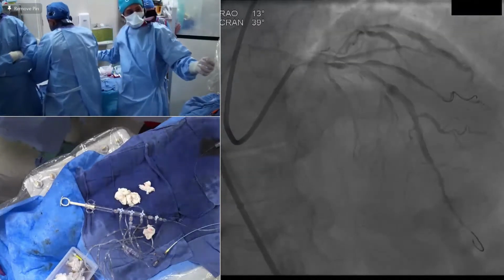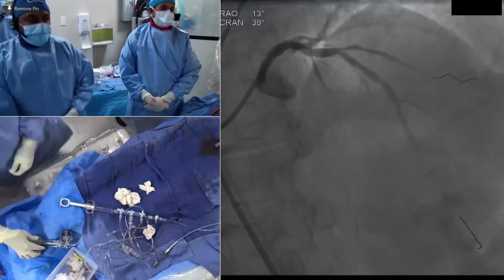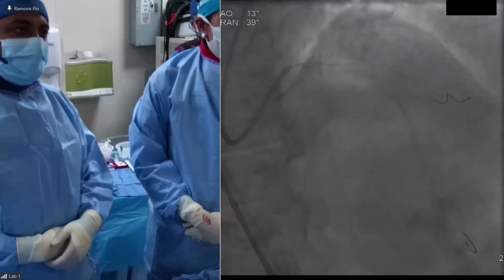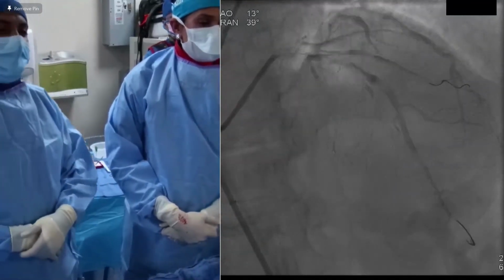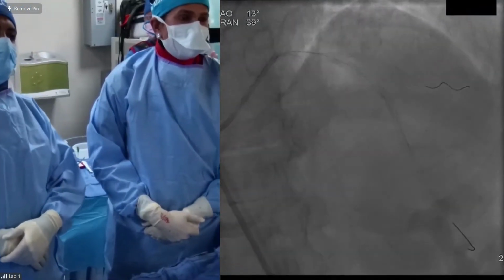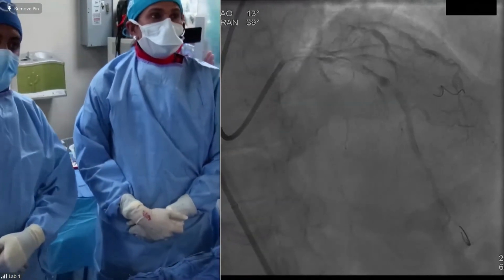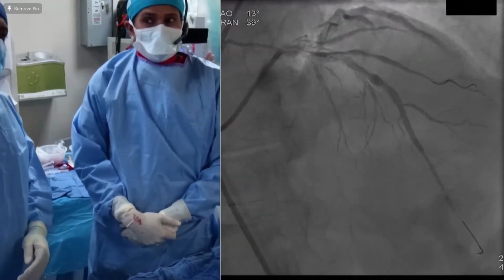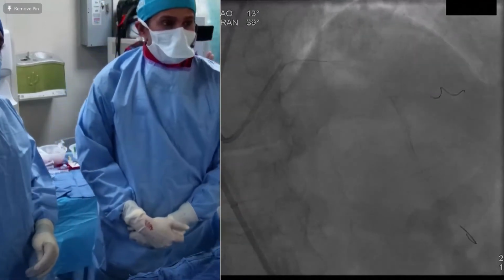Okay, now what do we do here, guys? All right, looks good. What do you want to do now? What does the app say? Forget about what we're going to do. What does the app say? Dr. Kini? Based on the app, this will be a two-stent technique since there's a significant lesion in the diagonal and the length of the lesion was just about 10 millimeters.